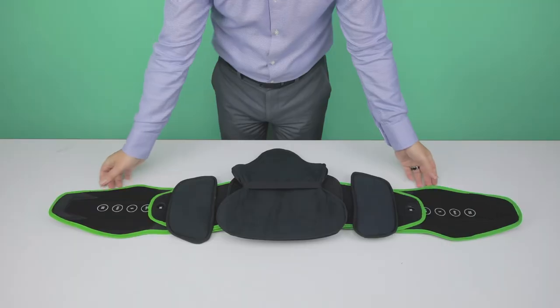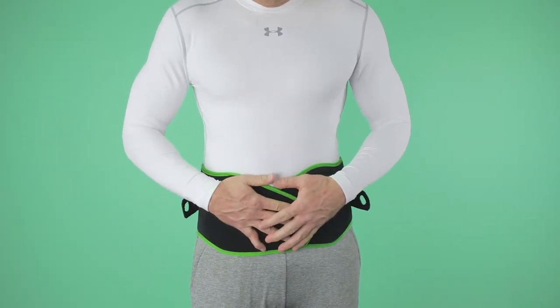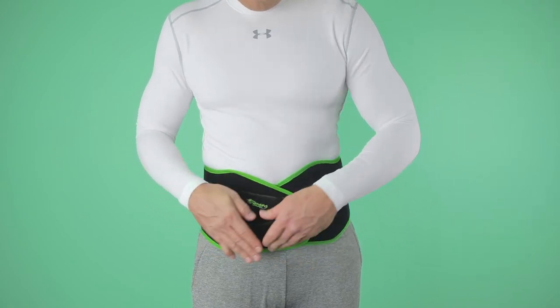To fit the brace, place the left soft panel against your abdomen. Place the right soft panel on top of the left panel. Pull the handles outward to achieve desired compression and fasten onto the front soft panel.